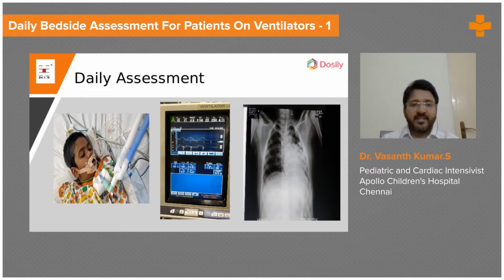For pediatrics, if you take the internal diameter multiplied by 3, that will be the distance at which the ET tube has to be fixed. For example, if it is a size 5 tube, it has to be fixed at a length of 15 centimeters. And you have to ensure that the fixation is appropriate. Here you can see this Dynaplast is going till the preauricular angle, till the ear. Sometimes if the ET tube is not fixed properly, there are chances that it can get displaced. So it is very important to see if it is fixed appropriately.